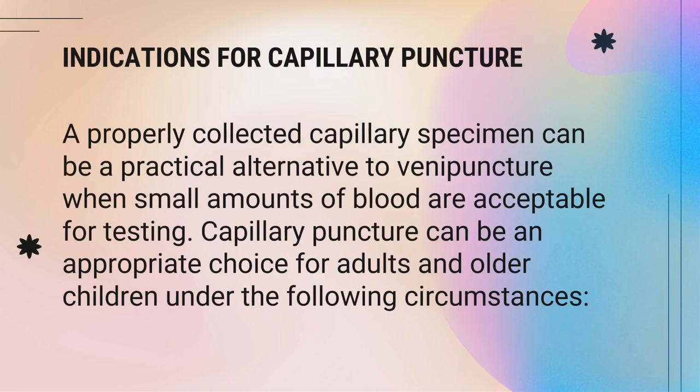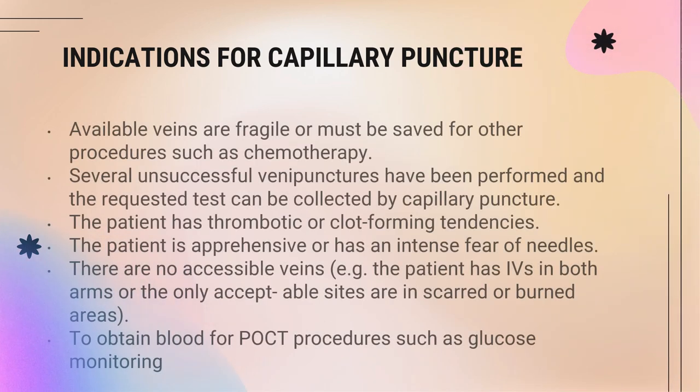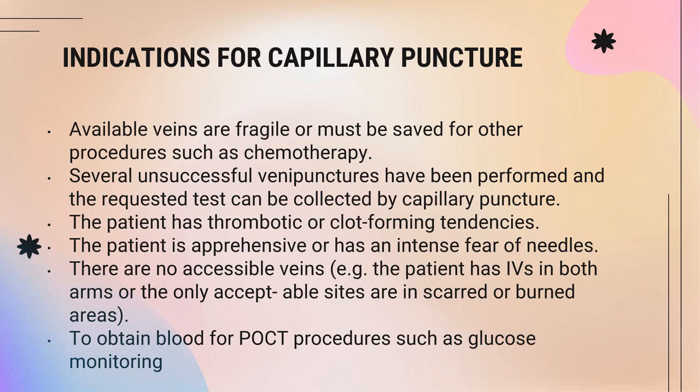So a properly collected capillary specimen can be a practical alternative to venipuncture when small amounts of blood are acceptable for testing. It can be an appropriate choice for adults and older children under the following circumstances. So, the different indications for you to do the capillary puncture: if the available veins are fragile and must be saved for other procedures such as chemotherapy.